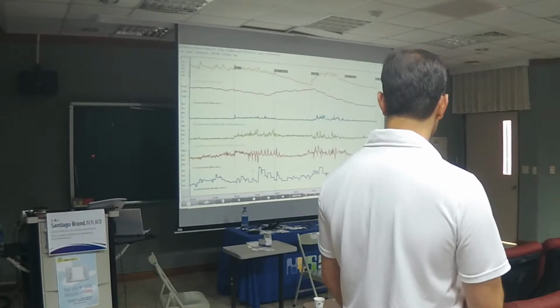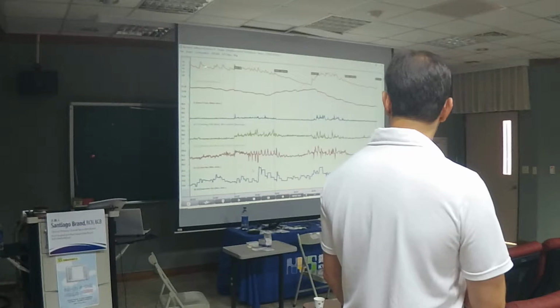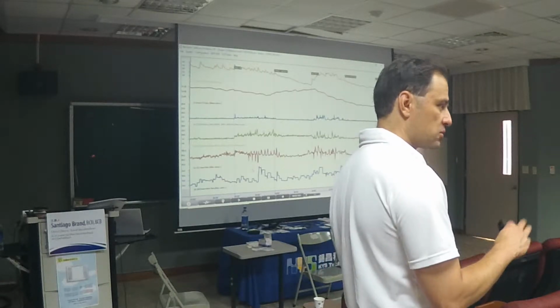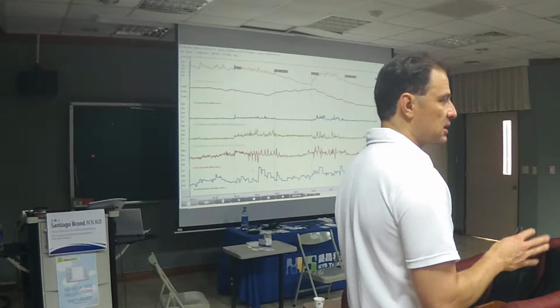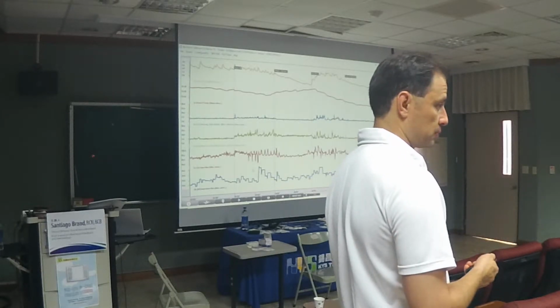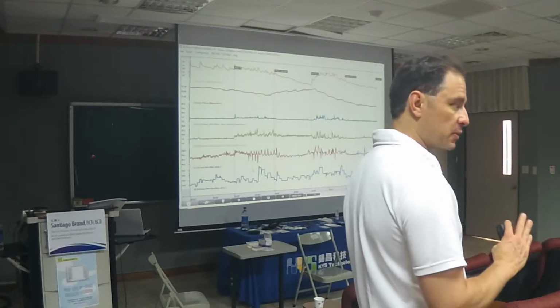All right, and temperature values 31, 32, and for GSR I go with 2.5 and below, sometimes 3 or lower. So 2.5 or 3 or lower. That's an acceptable value. Anything over 3, we have to pay attention to. All right. So respiration rate again, 5 to 7 breaths per minute, resting.